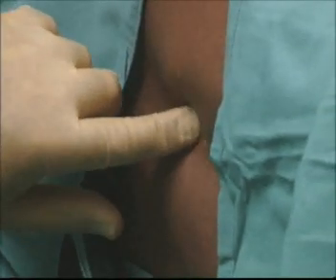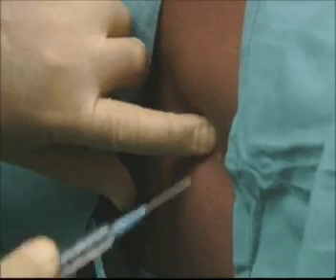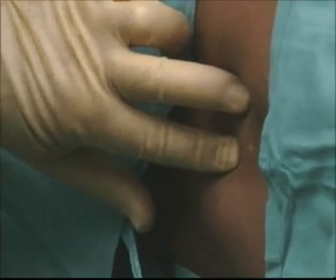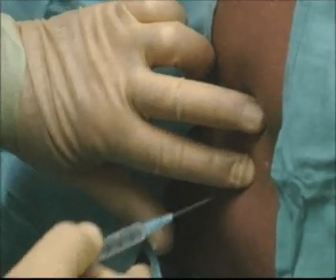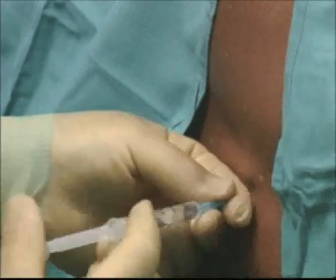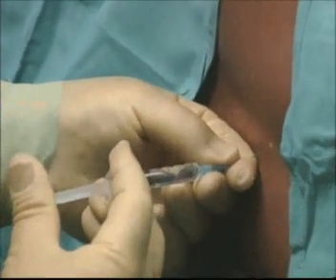Palpate landmarks to find the desired interspinous space and hold the chosen interspinous space between middle and forefinger. Raise an intradermal wheal of local anaesthetic one to two centimetres lateral to the chord of the two spinous processes, and infiltrate down to the vertebral lamina.